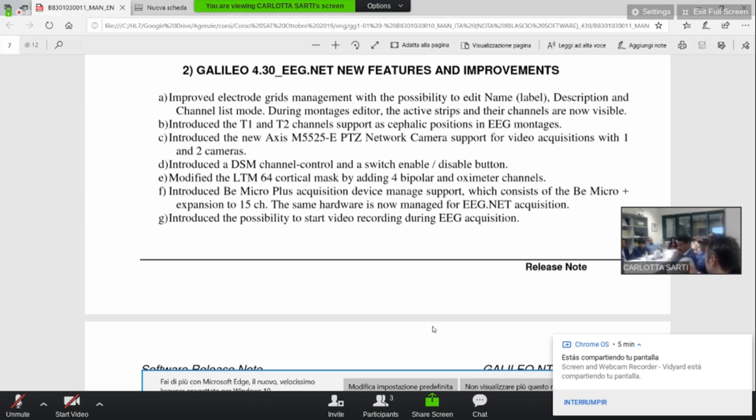Only when the doctor sees a particular movement of the patient, it starts the video. It's on demand. We call this type of recording on the fly. You can see the preset, the manager on the fly or standard type of video. We will see after.